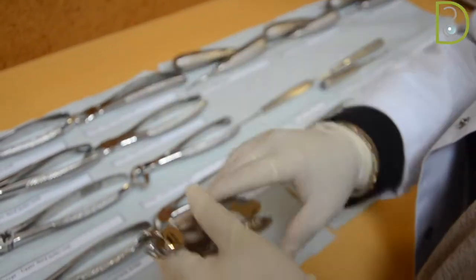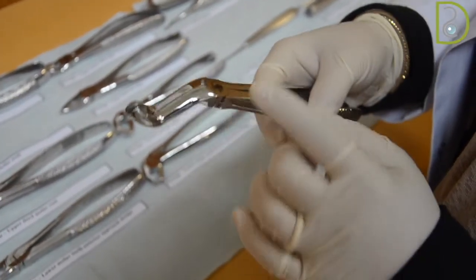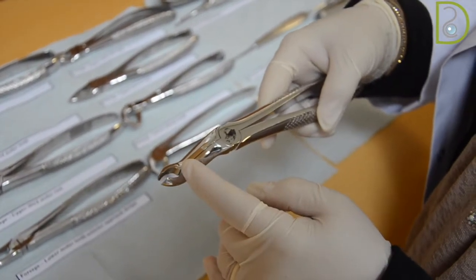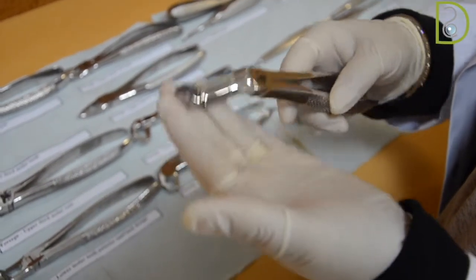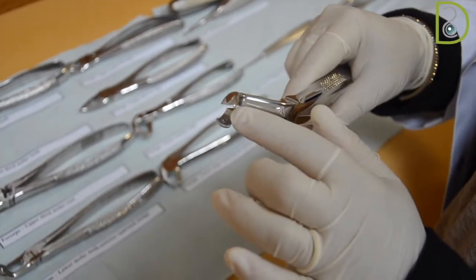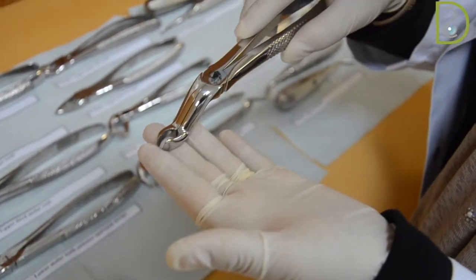Now we will talk about the third molar. The upper third molar has a lot of anomalies, and that's why you will find that both of the beaks are totally identical and without any projections, but it is angled twice, once at the joint and the second time at the beaks, to reach the third molar position, which is the farthest in the arch and the most difficult to grasp. There is nothing special about the beaks other than that they are broad, open, and a little bit roundish. This one is also called the bayonet forceps.